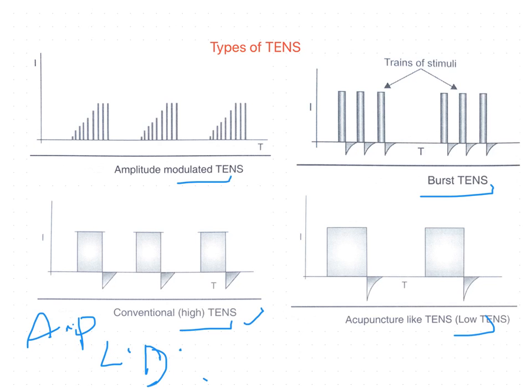So pain gate mechanism, here it is by blocking the small diameter fibers and allowing the impulses of TENS through the large diameter fibers. So the onset of pain relief is relatively fast. And we will see the parameters and the dosage after these modes.